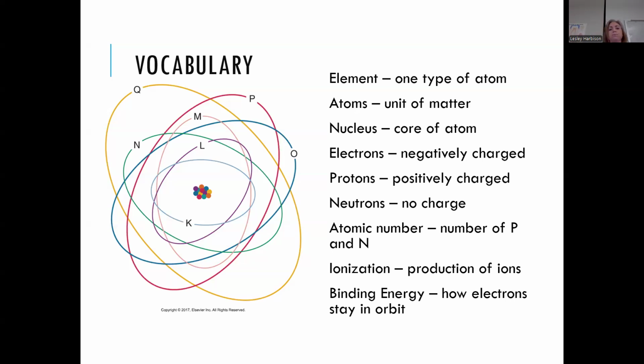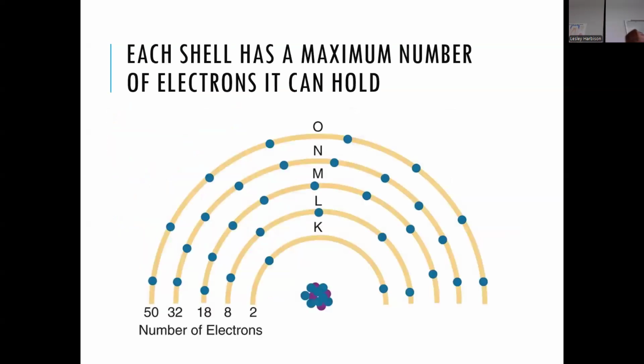When you refer to those sides, do you mean the way the X-ray looks, like it's either darker or lighter? Well, it can affect the way it looks, dark and light for sure, but we'll stay in the place of the actual X-ray photon that gets created, before we talk about its effects on the picture. If it's a very high powerful one, it bombs through stuff really well, it penetrates really well.